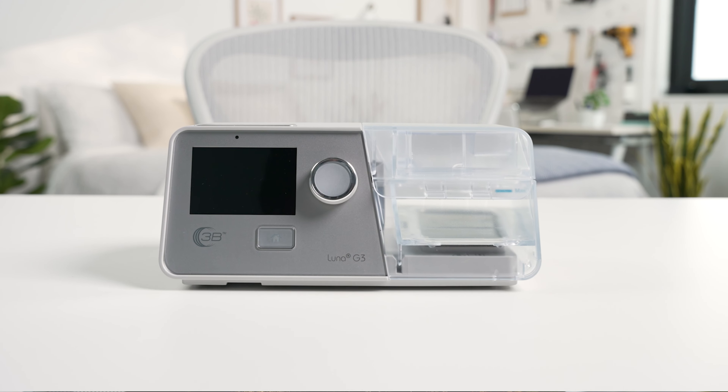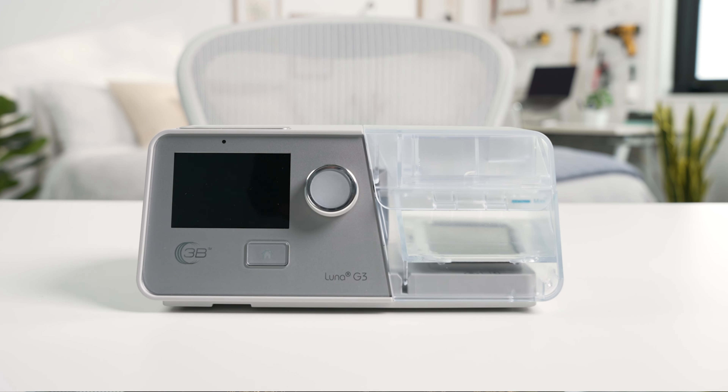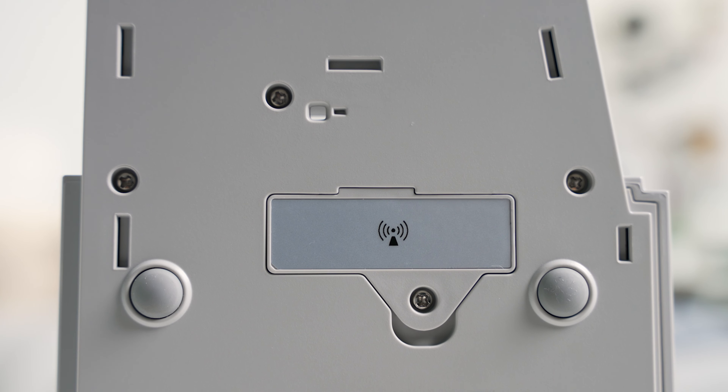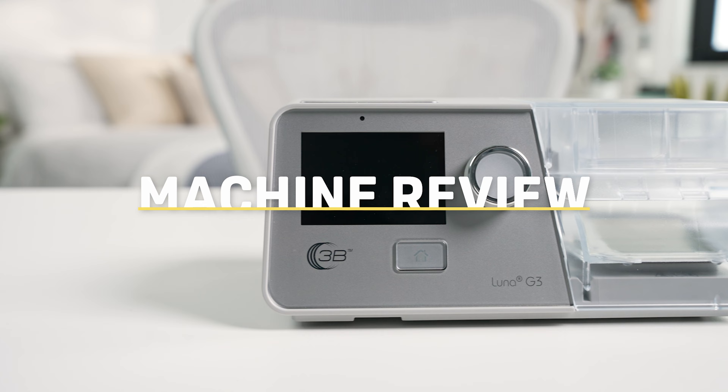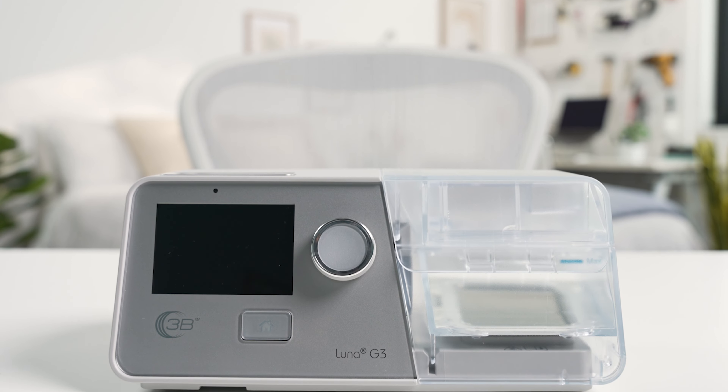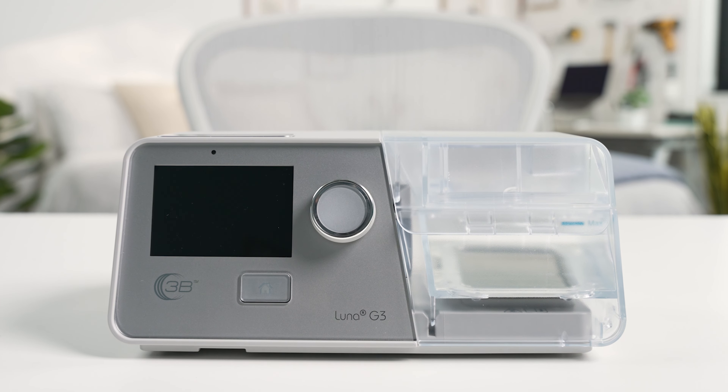If you have a hard time breathing during CPAP therapy, you may need a machine that automatically adjusts pressure levels between inhalations and exhalations. The Luna G3 BPAP machine from 3B Medical does just that. This is one of the most popular bi-level CPAP machines on the market. Today we'll break down this device's features, functions, and overall performance. Hi everyone, I'm Taylor, and today we're talking about the Luna G3 BPAP machine from 3B Medical.